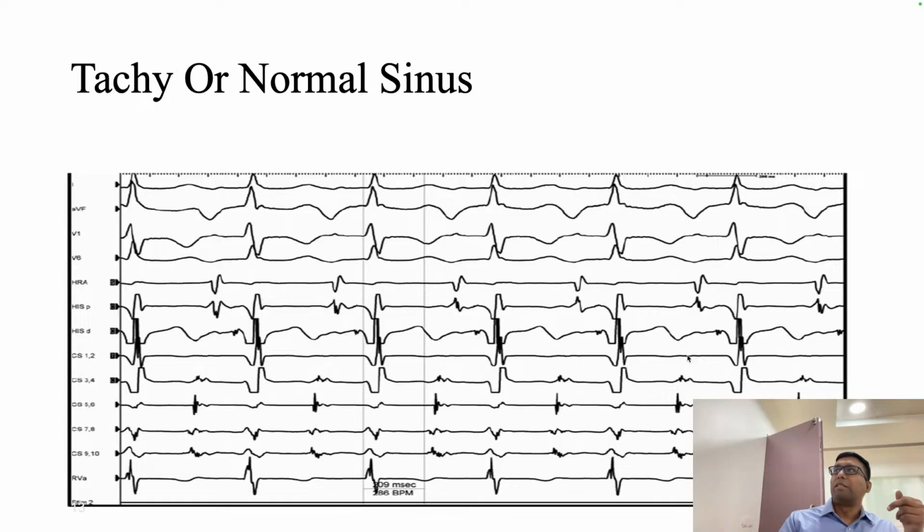And this is a basic ECG. I will not go into detail because this has all been discussed. Is it normal sinus, tachy, or sinus? Yes, sinus. Always start by asking, where is the P wave here? Where is the P wave?